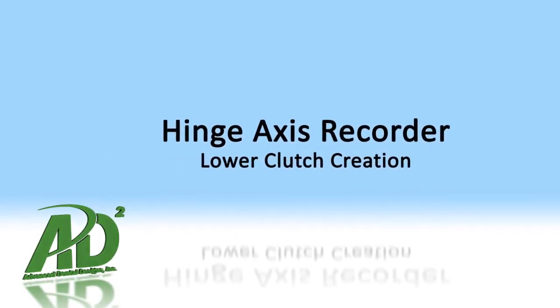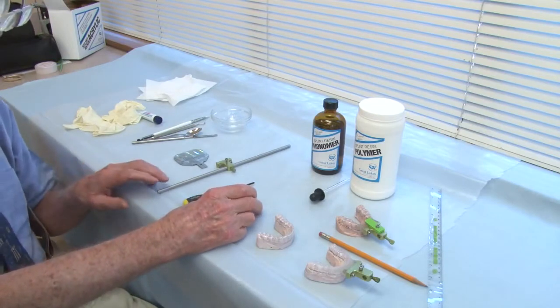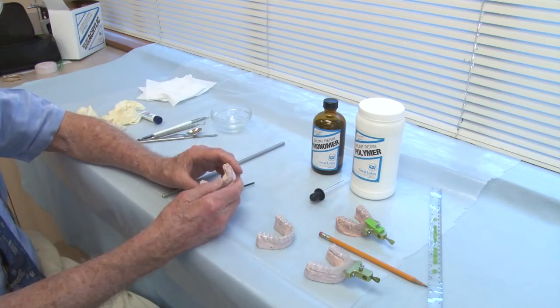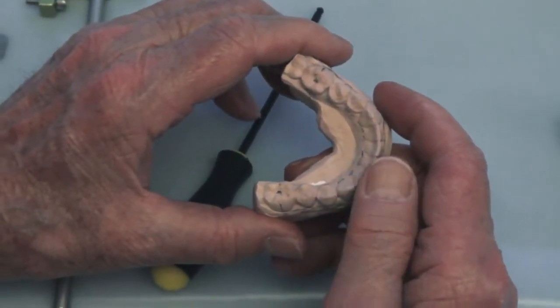Okay, I want to show you how to make the lower clutch. This is a very important step in preparing your instrumentation for your hinge axis recording. The first thing that you want to do is get a very accurate model of the lower teeth, and usually going to the distal of the lower first molars is adequate extension.